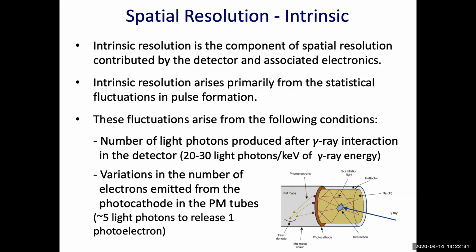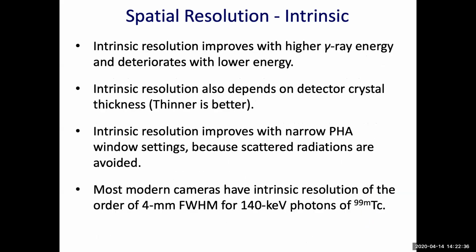All these statistical fluctuations inside the detector's components affect the intrinsic spatial resolution.